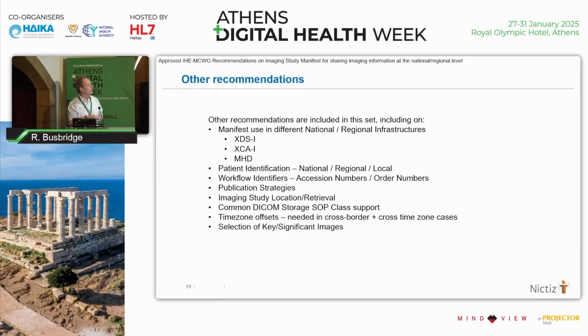Also on the location and retrieval, there are identifiers inside the manifest which allow you to use a direct URL, which will apply to the series level. There's a retrieval mechanism at a series level in the manifest that can be used directly to pull back images at series level. There is also a location ID or UID that could be used via some kind of addressing function to get the endpoint where you're going to find your studies.